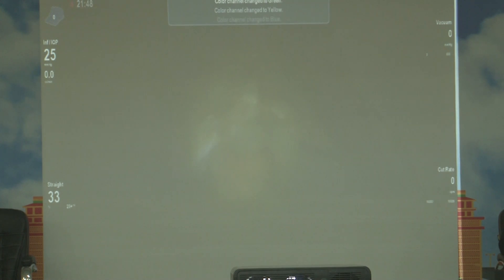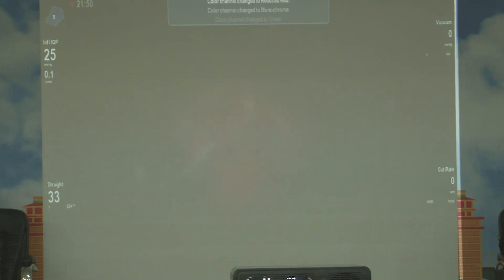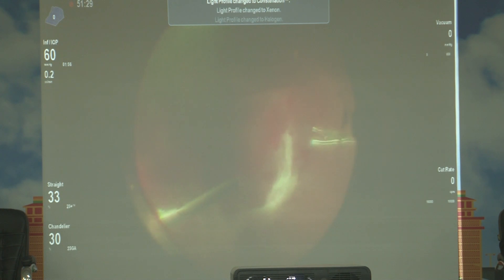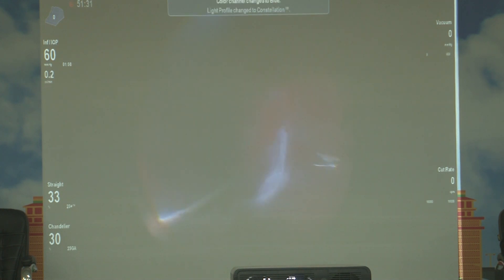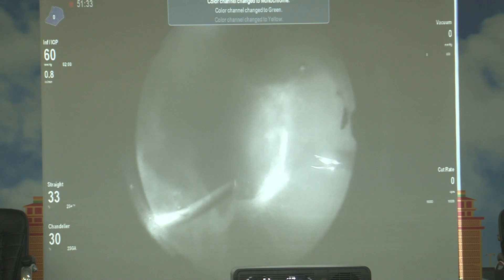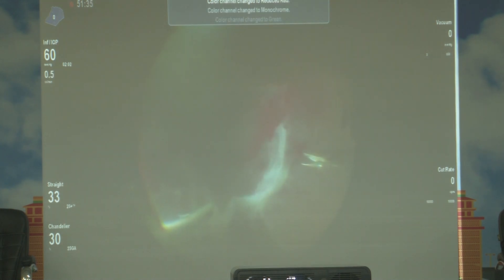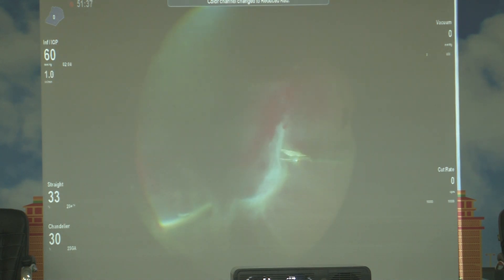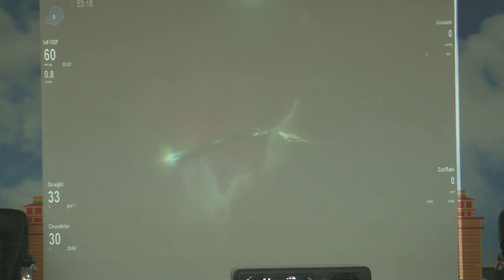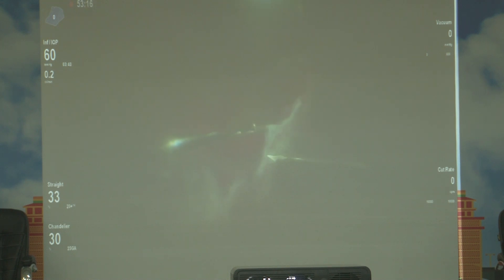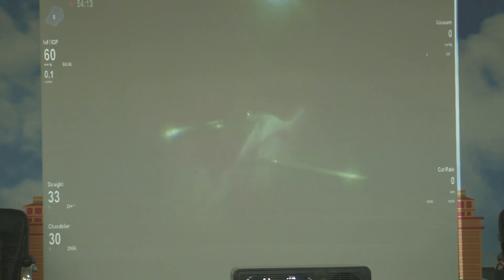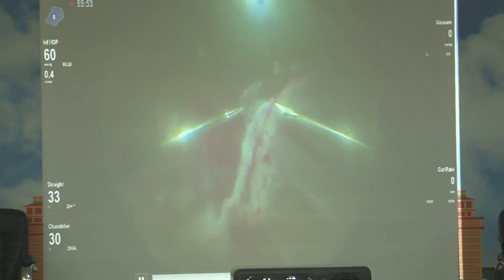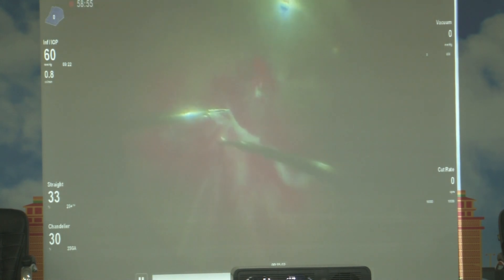You can see it's a very bloody red kind of appearance. Here I am using the red-free filter. Using the red-free filter definitely helps to fluoresce these membranes. It looks almost like fluorescent membranes — the visualization and fluorescence definitely improve. That is the advantage of using red-free filters.